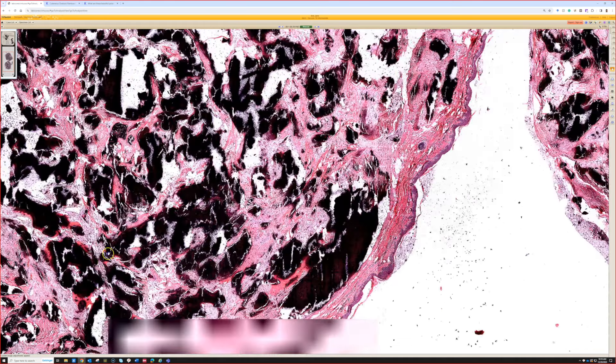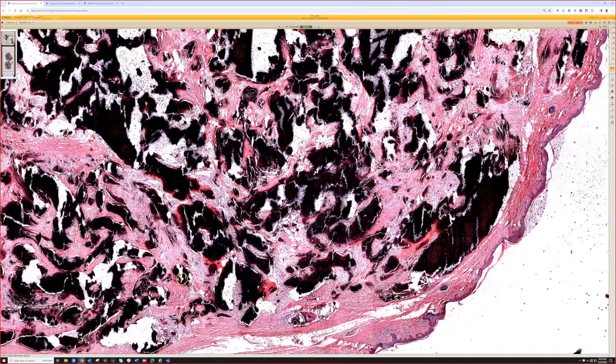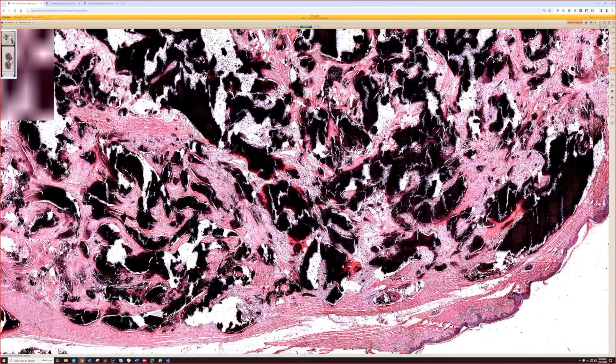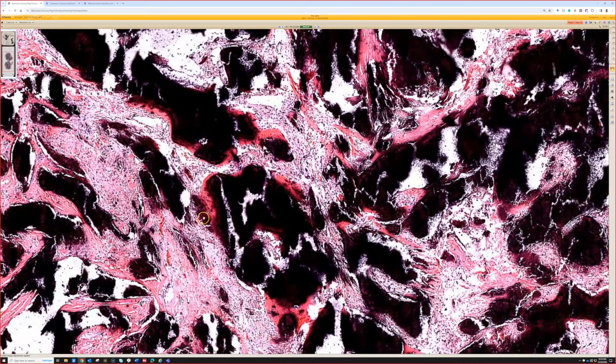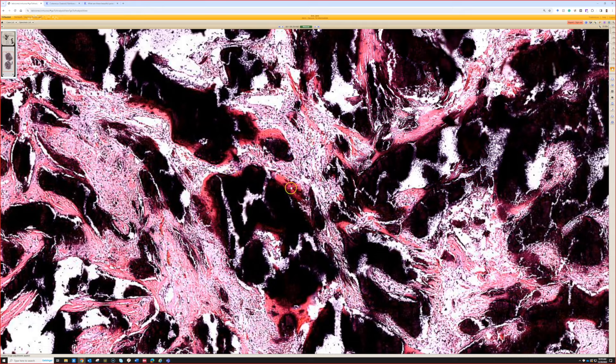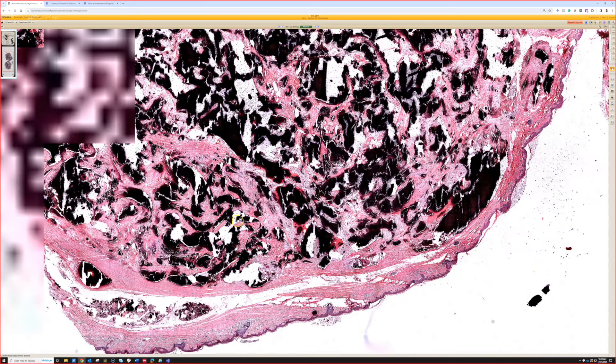Pilomatrixomas are benign hair follicle tumors. I've got lots of other videos about them and other examples showing you more classic findings with extensive blue basaloid cells and mitoses and giant cell reaction. They're more common in kids but adults can have them too. But this is just an example to show you that they can be extensively calcified and ossified. So here with the pink around it, that's probably some bone formation actually making osteoid like that.